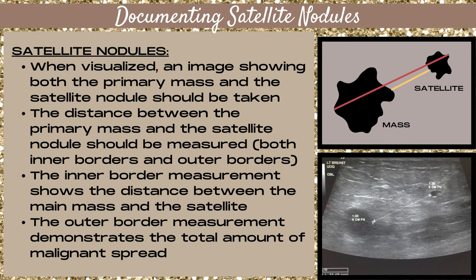You need to measure the distance between them — both the inner borders and the outer borders, as shown on the top image of this slide. The inner border measurement shows the distance between the main mass and the satellite mass, and the outer border measurement demonstrates the total amount of malignant spread. This should be done for each satellite mass that you encounter.